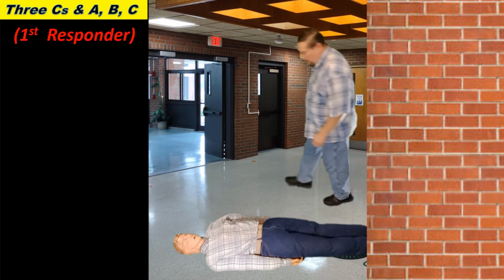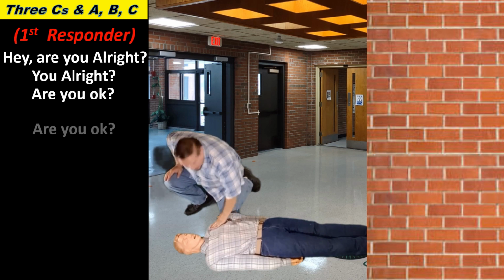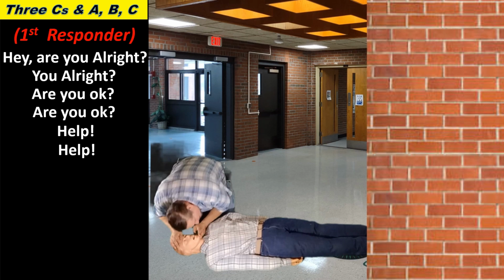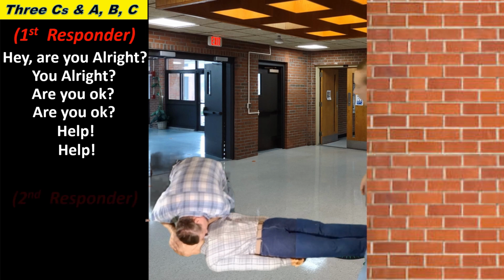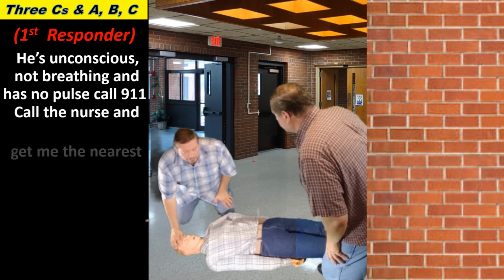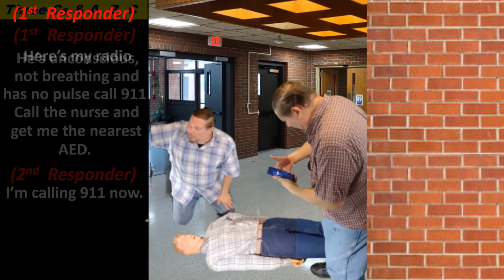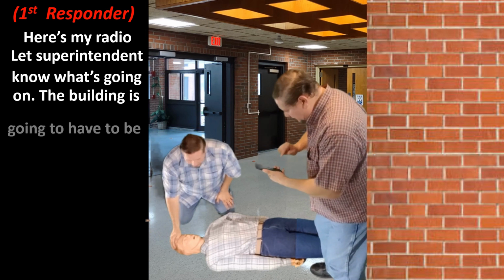Hey, you all right? Are you okay? Help! What's going on? He's unconscious, not breathing, and has no pulse. Call 911, call the nurse, and get me the nearest AED. Okay, I'm calling 911 right now. Here's my radio. Let the superintendent know what's going on. The building is going to have to be locked down.